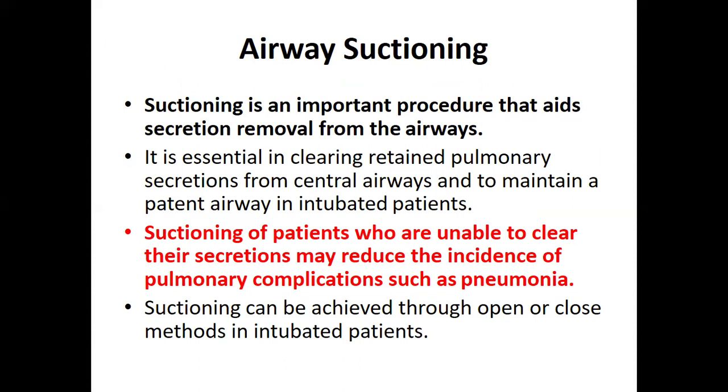Then in trying to clear the airway, you can also do suctioning. Suctioning is an important procedure that aids secretion removal from the airways. It is essential in clearing retained pulmonary secretions from central airways and to maintain a patent airway in intubated patients. Suctioning of patients who are unable to clear their secretions may reduce the incidence of pulmonary complications such as pneumonia.